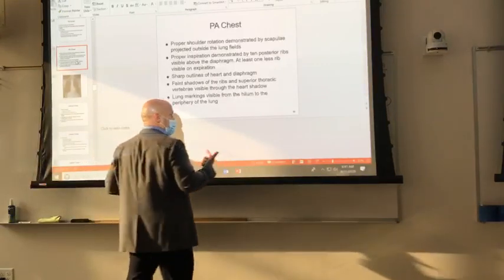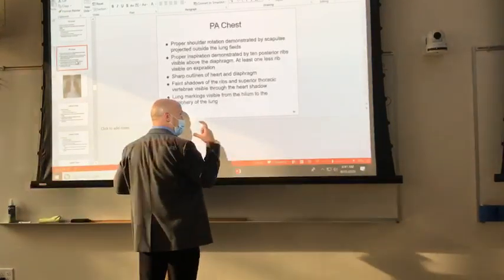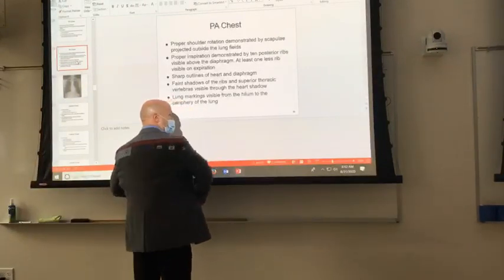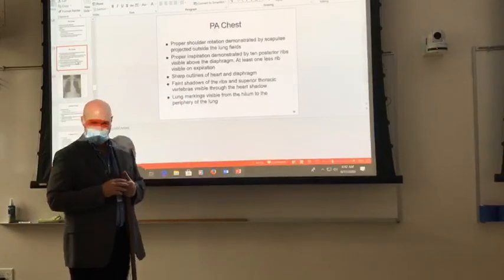PA. You're going to position the top of the image receptor 1.5 inches above the outer portion of the relaxed shoulders. You're going to rotate the shoulders in. What was the purpose for rotating the shoulders? Move the scapula. Move the scapula.